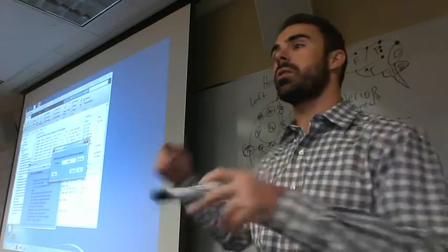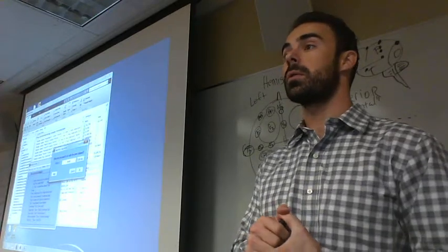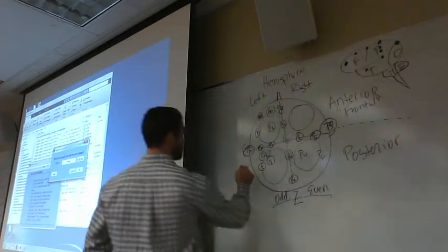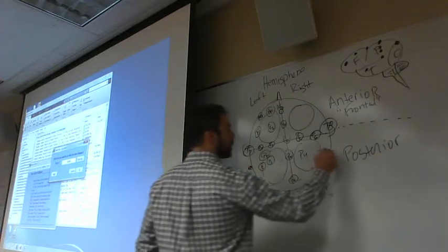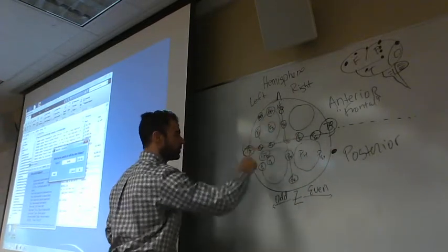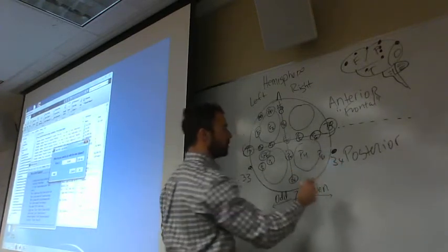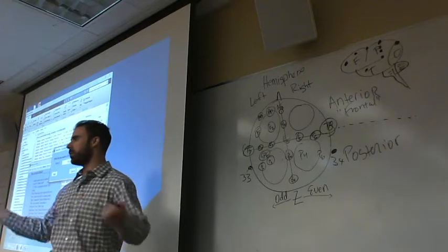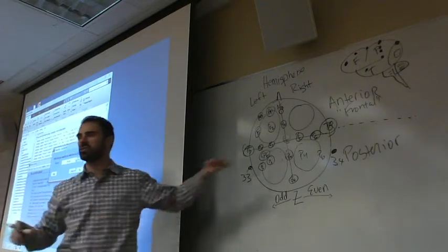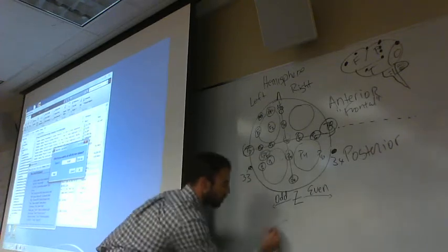Now remember, we started the conversation talking about the mastoids being referred to as numbers 33 and 34. Our mastoids are basically back down here and back down here. And all of these electrodes constitute our 32. This would be, say, 33, 34. And of course, they all have a number, 1 through 32, that go along with them. But we see it shown with our labels instead. This is 33, 34.